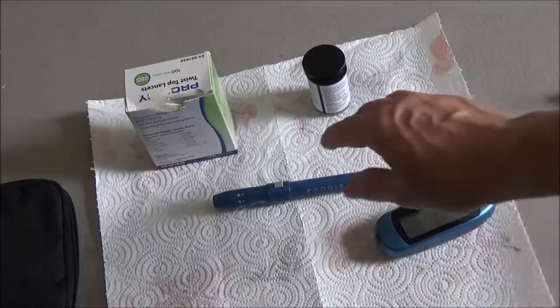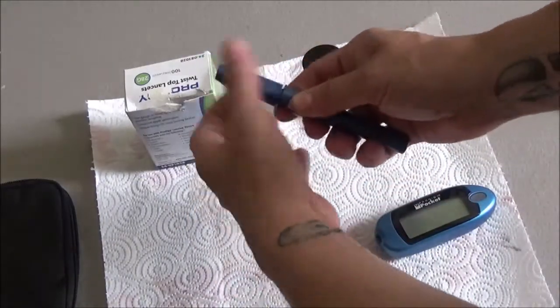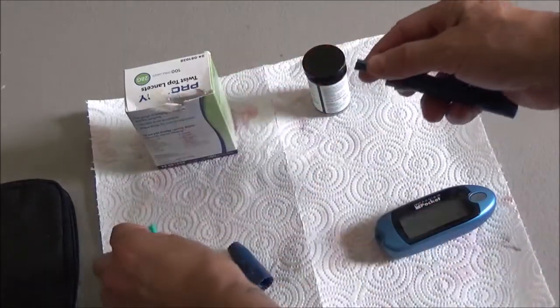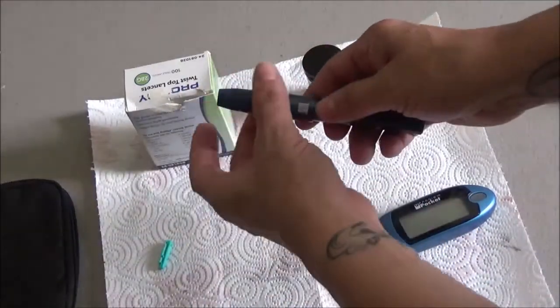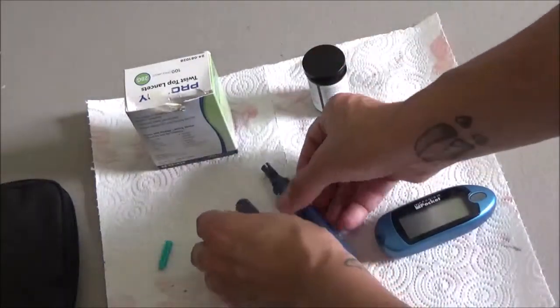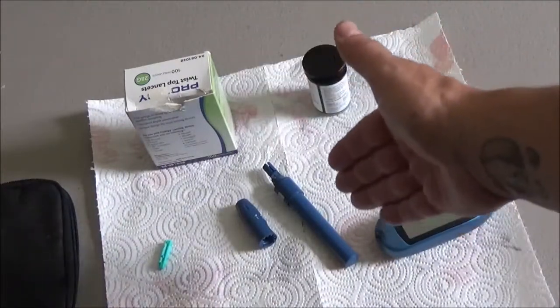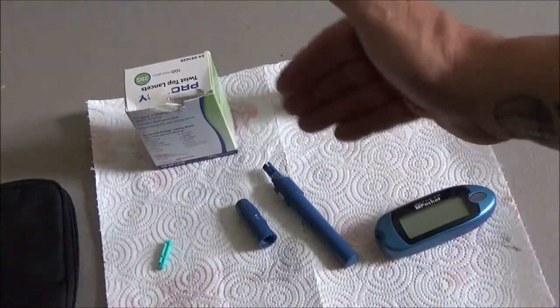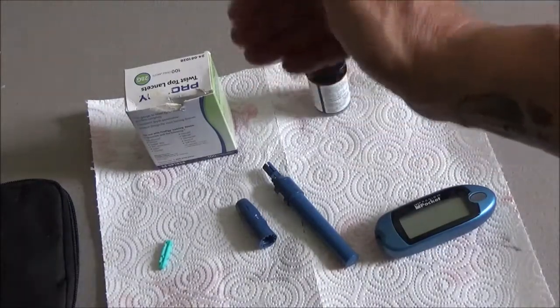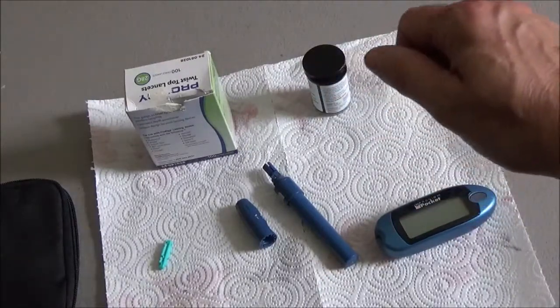So in order to do that, you open up the lancet holder this way, and you unscrew it, and look, that's a dirty needle that's been used. So you must be always careful that a lancet holder does not have a used needle inside it. In fact, the safest thing is to leave a lancet holder on a countertop in the open position so that anyone wanting to use that knows that it's clear of a possible contaminated needle. This is very important for future nurses to know.